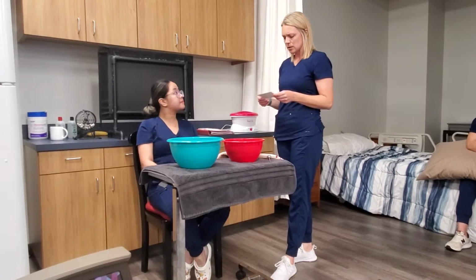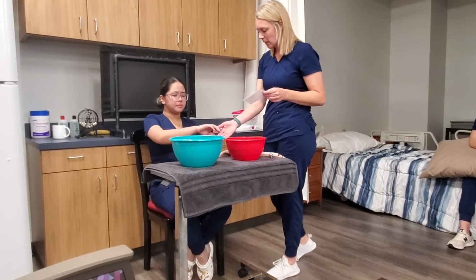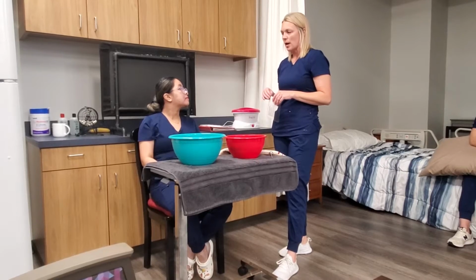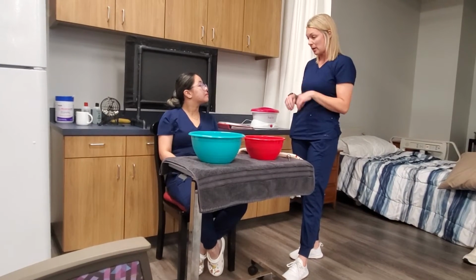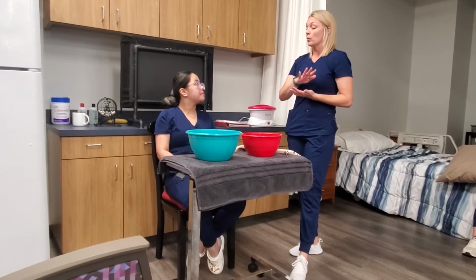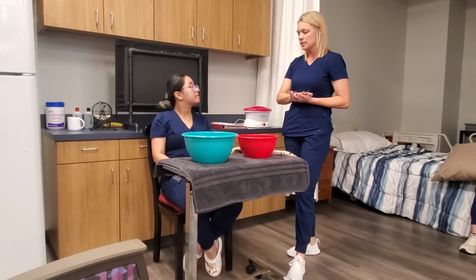No. Again, I didn't see any scars. You don't feel like there's any infection? No. Okay. And I didn't see any. It looks good. Okay. And has anyone ever told you that you have carpal tunnel syndrome? Oh no. No. Okay. Alrighty, so because you are stiff and painful, we're actually going to begin in our hot bath and we will end in our hot bath, okay? We're gonna go back and forth 5 times.